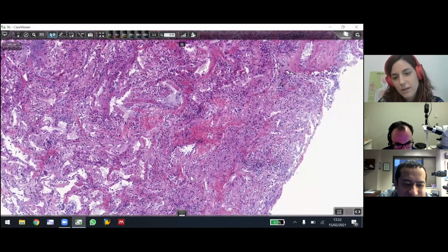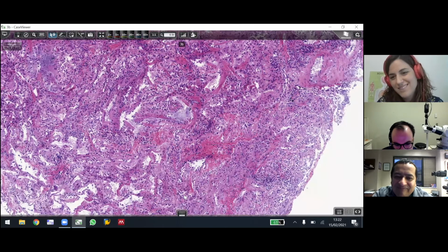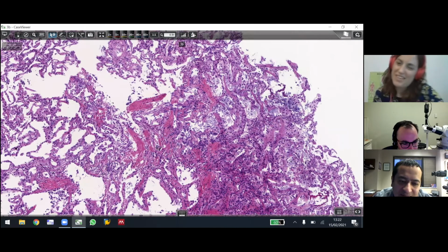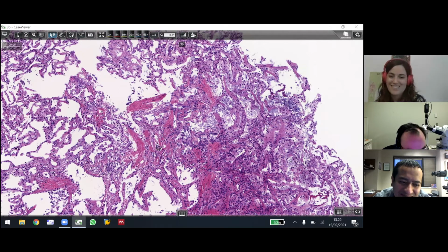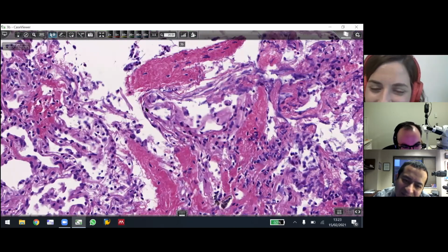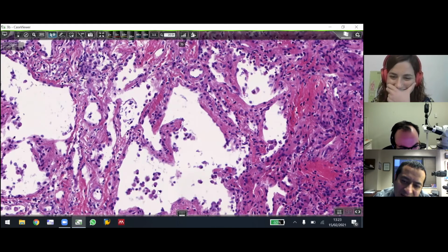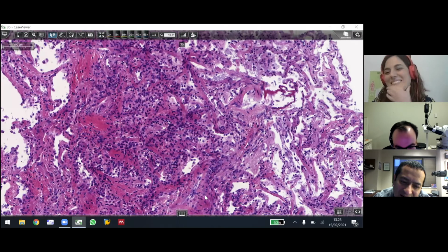What would you say about this cryobiopsy? Nothing? Not much. Matt, do you want to take it? What would you say about it? How would you sign it out? I think I'd be descriptive, but is that fibrin in the air spaces, or what's that pink stuff? Yeah, that is wavy. It looks more collagenous than fibrin, but the shape is weird. It's not really conforming to the air spaces.